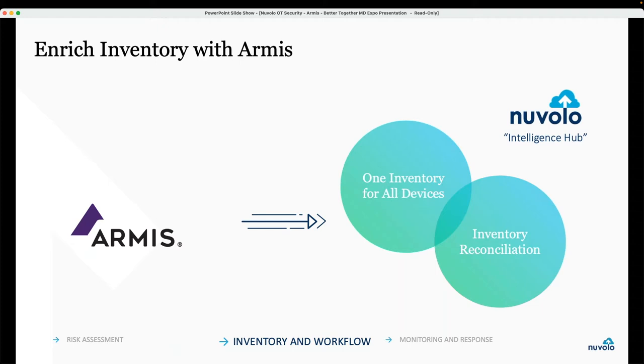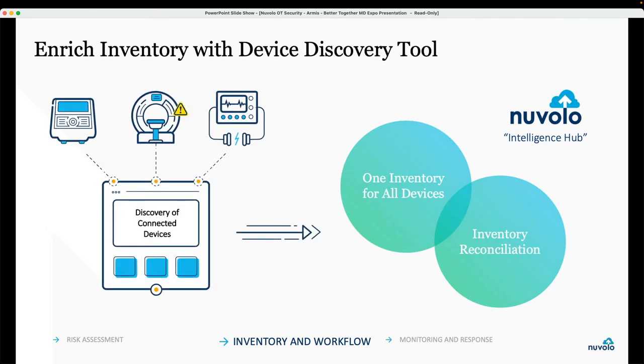What we can see here is we've got the transfer of data. You need the technical information now that you didn't necessarily need 5-10 years ago. And we need that in our device record so that we have that complete inventory and there's an understanding of what the technical information is. What's the particular software version you're rocking? What, at times, even the hardware version, because that's going to determine to some extent how far you can go with certain patching and upgrades.